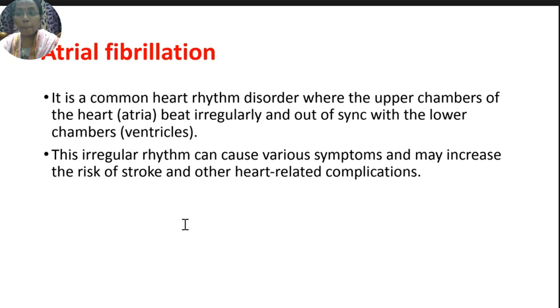Then the abnormal PR interval: the prolonged PR interval and the shortened PR interval are also commonly seen abnormal ECG waveforms. The prolonged PR interval may suggest first degree heart block. If we diagnose at the prior stage, we can treat it properly.